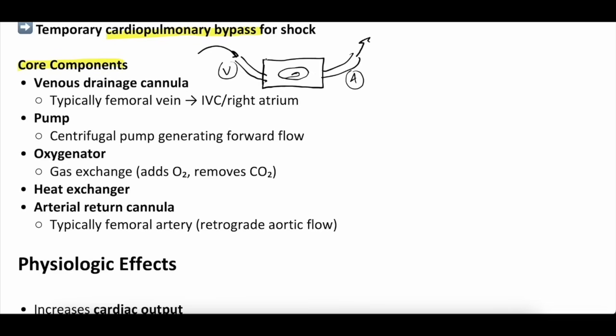The other part of this is we said it oxygenates, right? So there's actually an oxygenator as well. And the oxygenator pumps oxygen into the blood and removes carbon dioxide out of the blood. So if we try to pull all this together, we're going to draw. Apologies if you're listening to the podcast version. We're doing some really terrible drawings that are hopefully helpful for understanding, but obviously you can't see that on the podcast.